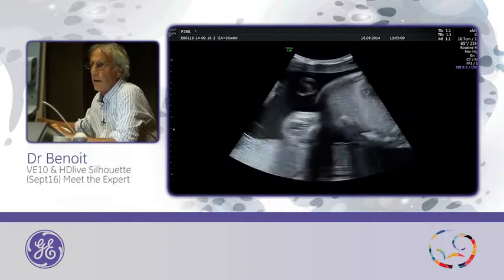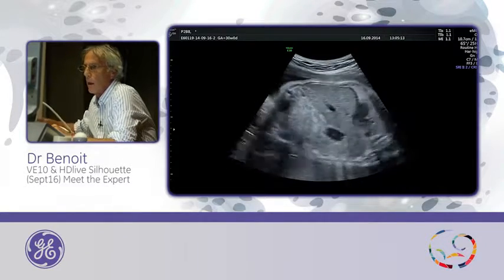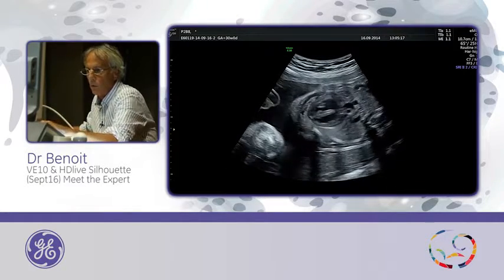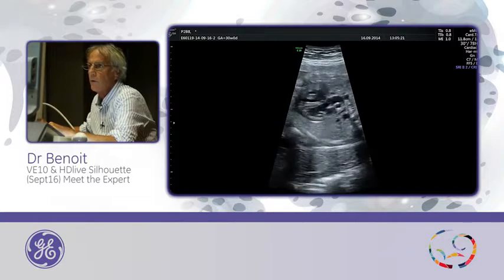So what else can I do? We can do a real-time 4D on the fetal heart when you have the four-chamber view. Yes, so I will go with the cardiac settings here. This is a cardiac setting.